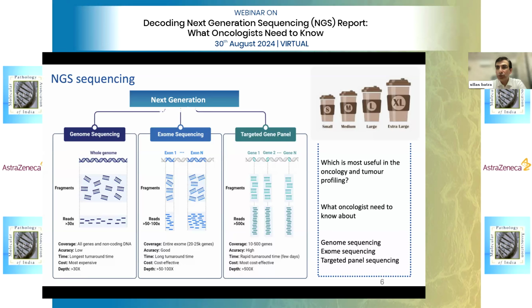Okay. So it also depends upon, in exon 18, 19, 20, 21, whether you have taken a part of exon 17 or not. If there is something at the side of that, does it make a difference? Dr. Suruchi, can you answer that one for me?